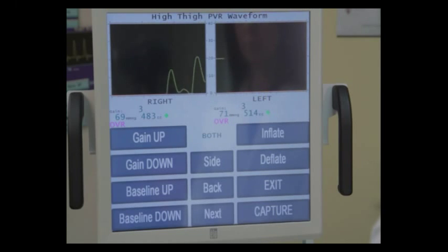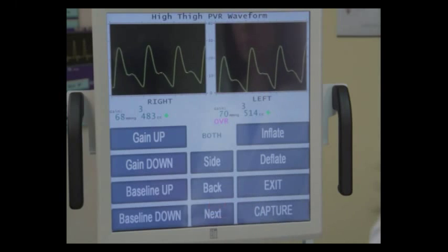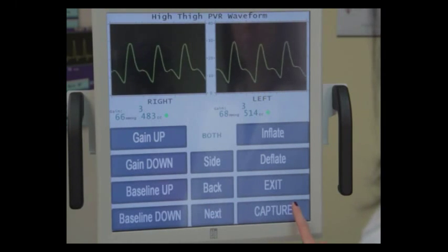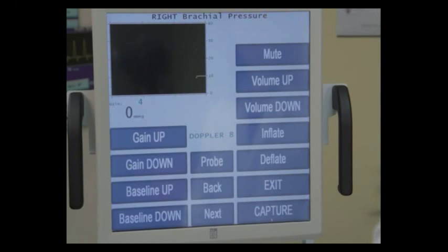You'll see the OVR on the left side because the pressure is slightly above 68. If you wait just a moment, that will usually settle in like it did now, and we can capture any time. We're now going to press next, which will take us to a different part of the examination.